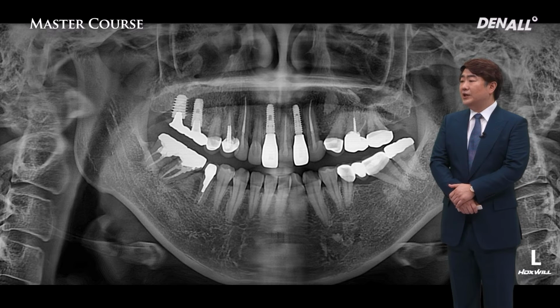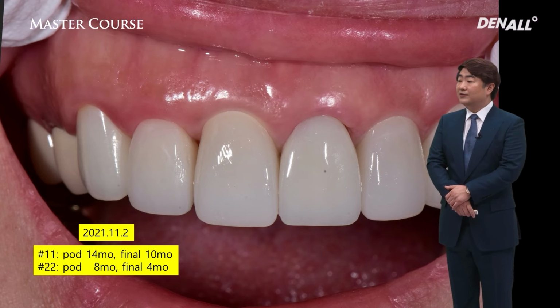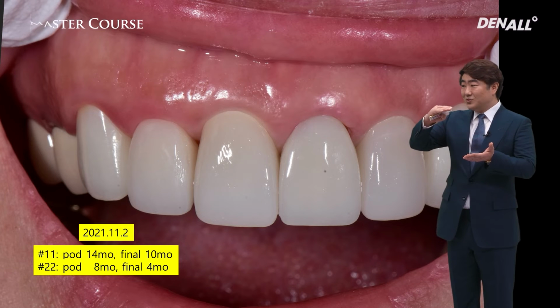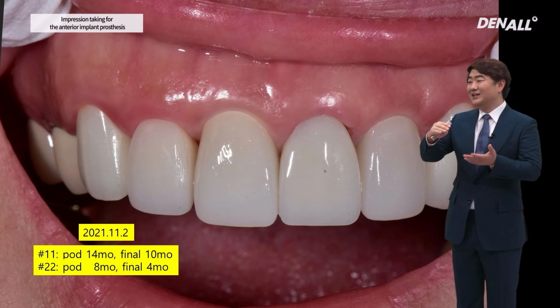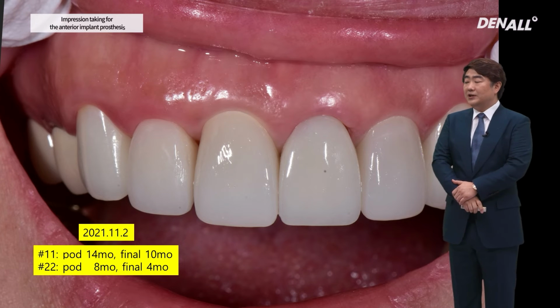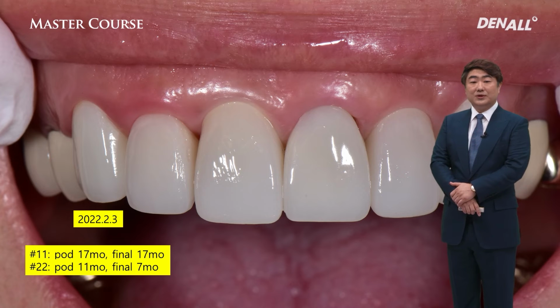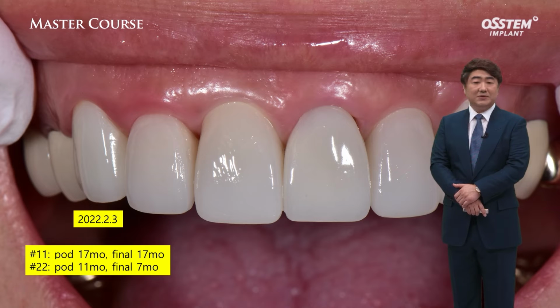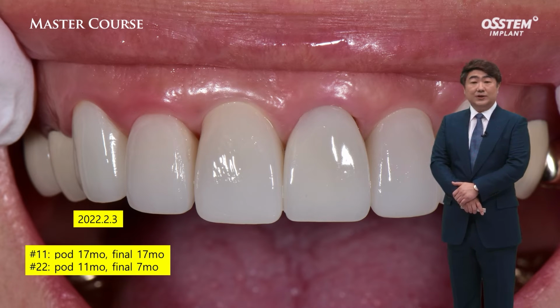A few months later, this is from June, then again 5 months had passed, and we took this photo. In number 11, there's a bit of stabilization, and in number 22, the margin level is not really clear. In a more recent photo, number 11 now has a margin level the same as the adjacent teeth, but number 22 seems to have stabilized after the collapse.